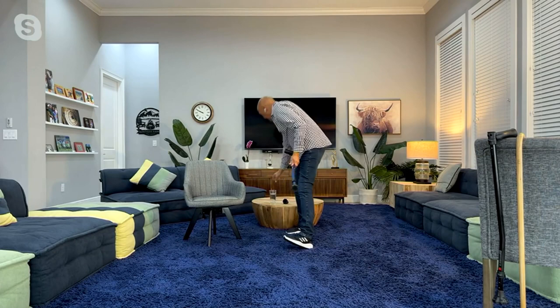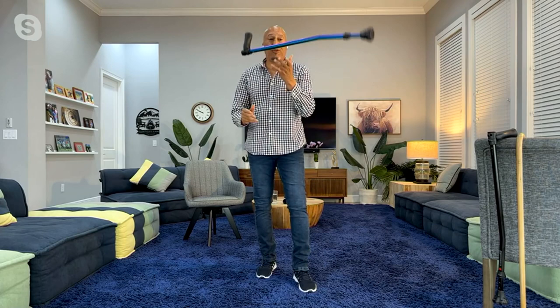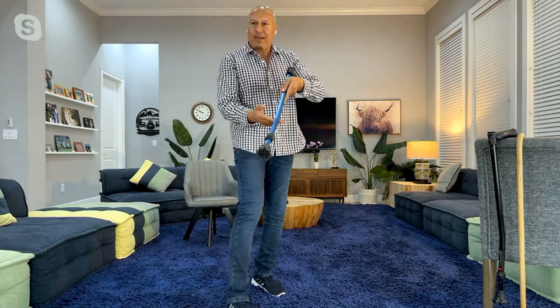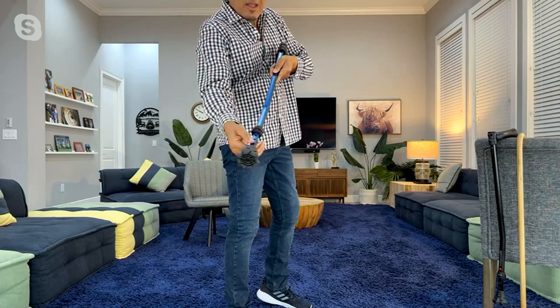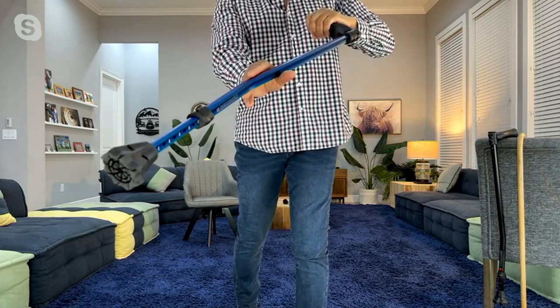This cane weighs less than this glass of water — 18 ounces. And this cane will hold 300 pounds of weight. Very, very lightweight. The adjustment is wonderful and easy. The business part is on the back — all you do is pop this up, slide it anywhere you want to make the adjustment, and pop it back in. That's all you do. Aircraft aluminum, beautiful finish. It comes in black and it comes in blue.